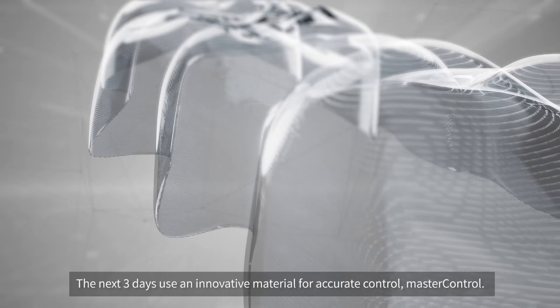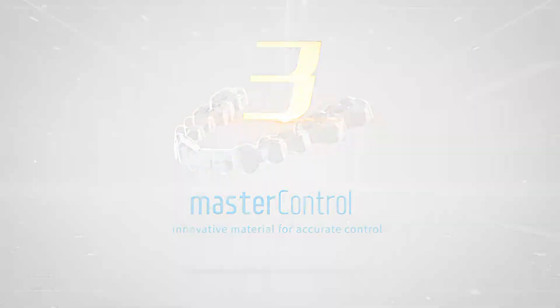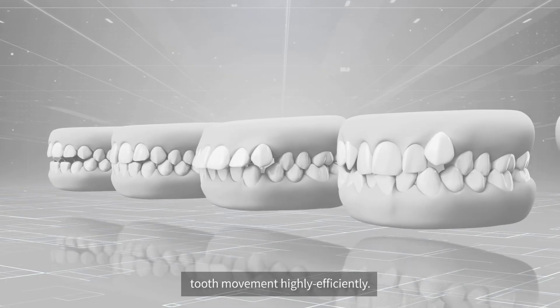For the next 3 days, use an innovative material for accurate control: Master Control. The innovative material crafted with ingenuity controls tooth movement, making it highly efficient.